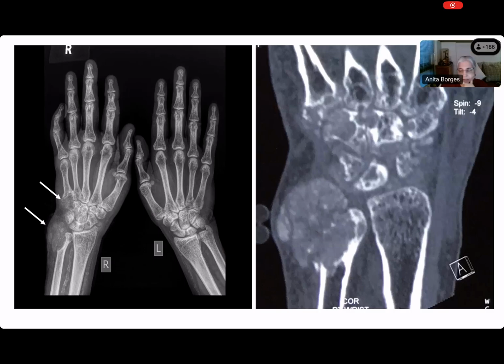Very good. And how would you describe that lesion? It is a lytic lesion with irregular borders. All right. What is it that you should know about an X-ray? Because we do it once here, and I think most people should be able to do it in all of the cases. We have 4 cases to look at. So come on, what do you have to say about reading an X-ray?